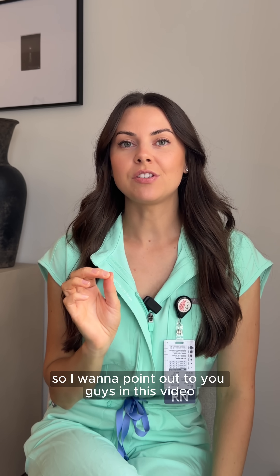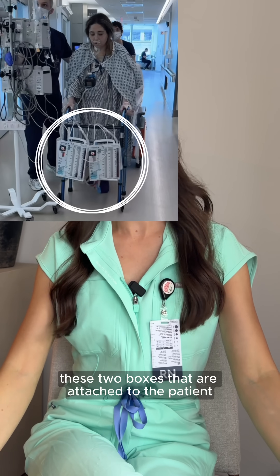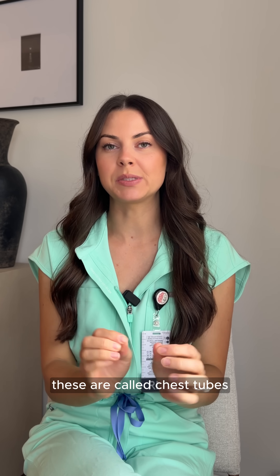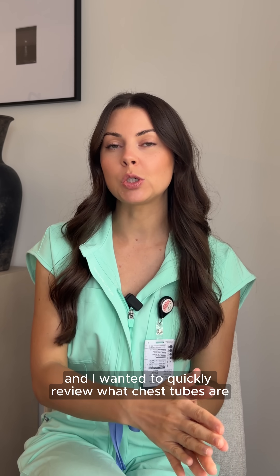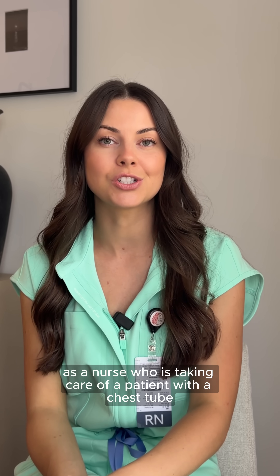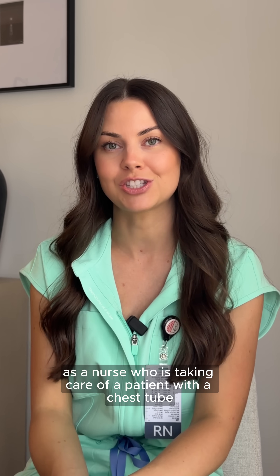I want to point out in this video these two boxes that are attached to the patient. These are called chest tubes, and I wanted to quickly review what chest tubes are, what they're used for, and things to watch out for as a nurse who is taking care of a patient with a chest tube.